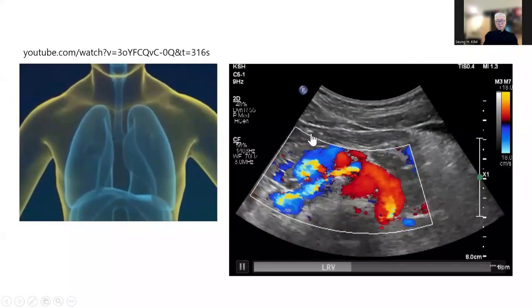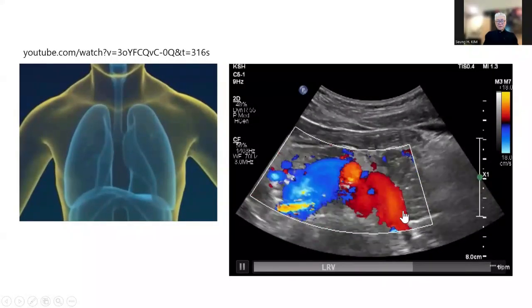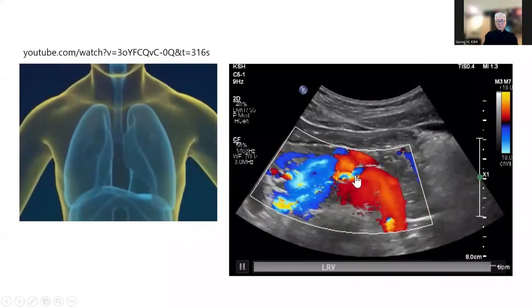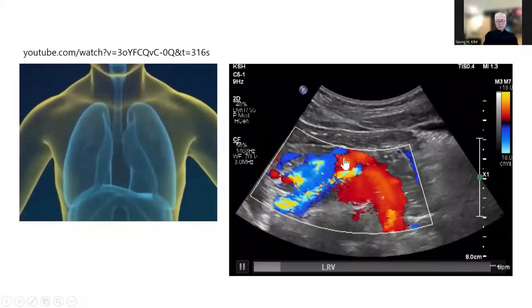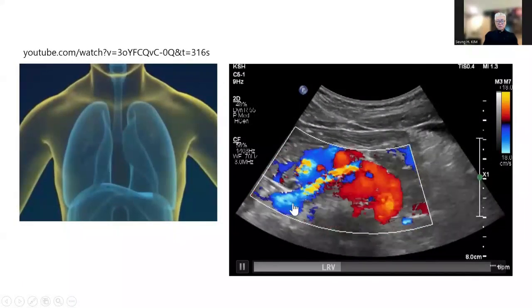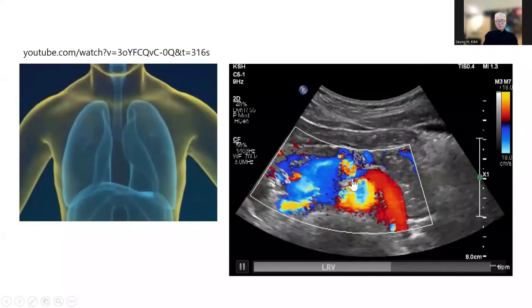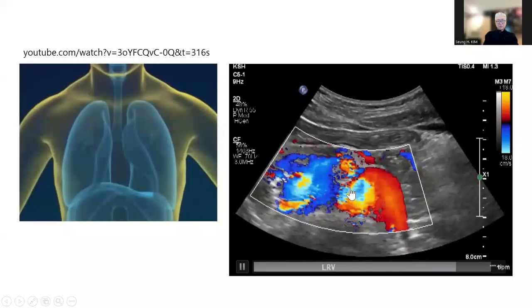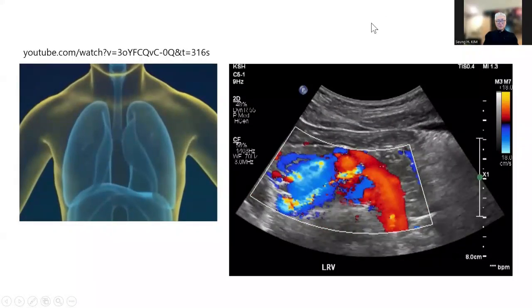With patient respiration, with color Doppler ultrasound, we clearly see the left renal venous flow here, and the fast flow between the aorta and the superior mesenteric artery, and the bright color, the jetting flow here. So we do not need to ask the patient to hold the breath, because if we do this repeatedly, the patient feels exhausted.